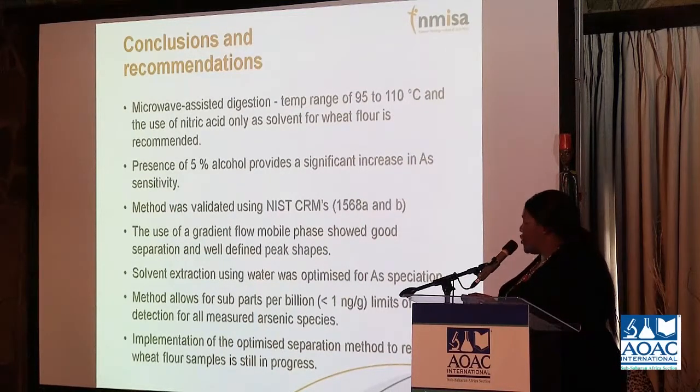A solvent extraction using water was what we opted for, and we optimized for arsenic speciation. This shows that the method also allows for sub-parts per billion limits of detection for all the measured arsenic species. The implementation of the optimized separation method will be applied to the real wheat flour samples, and that's still in progress. Thank you very much.